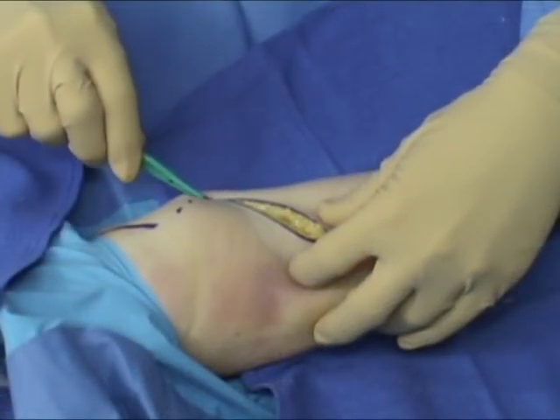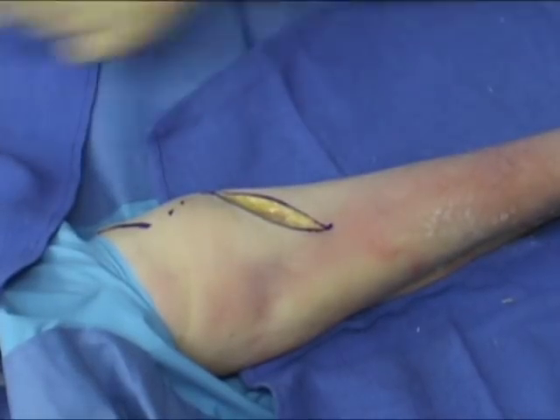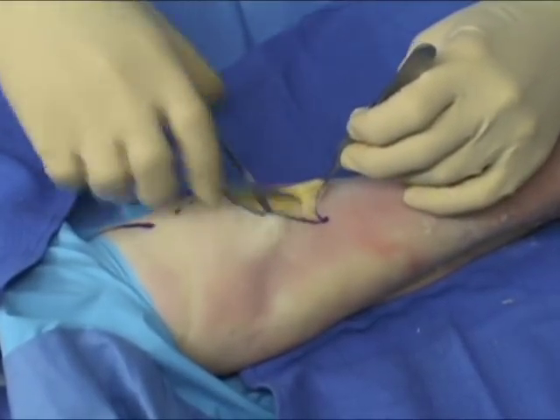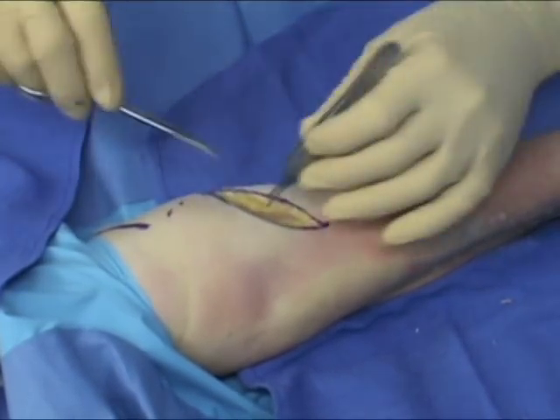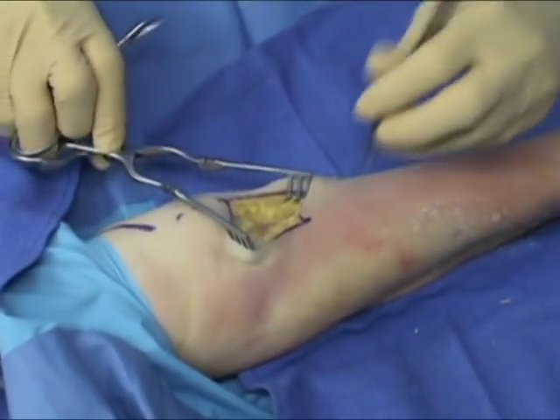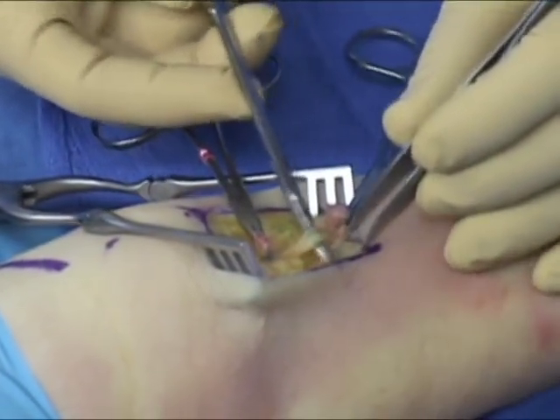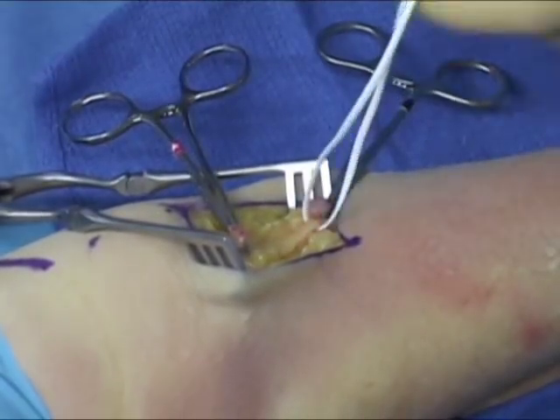An 8 to 10 centimeter oblique proximal medial to distal lateral incision is made just distal to the antecubital fossa. Subcutaneous dissection is carried out carefully. In the lateral aspect of the wound, the lateral antebrachiocutaneous nerve can be identified. Nearby veins should be ligated and a vessel loop placed around the lateral antebrachiocutaneous nerve.